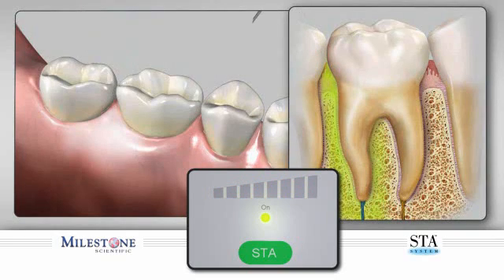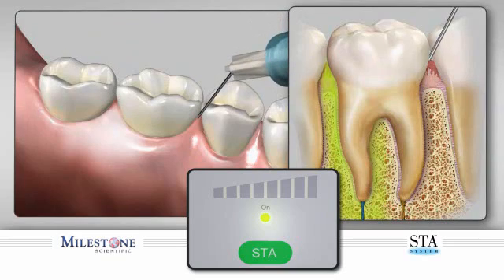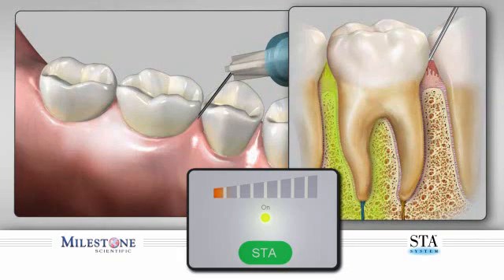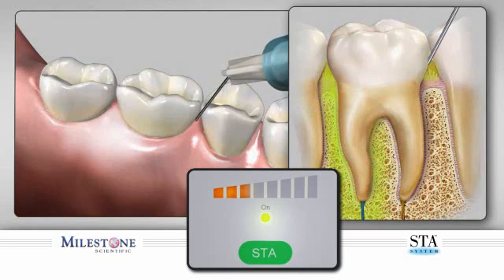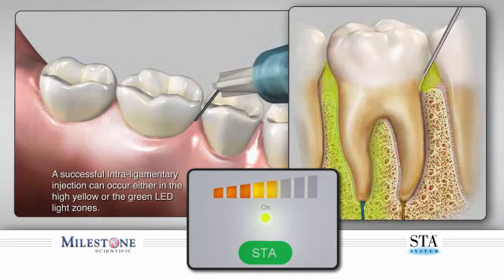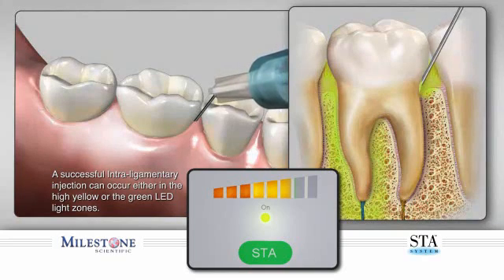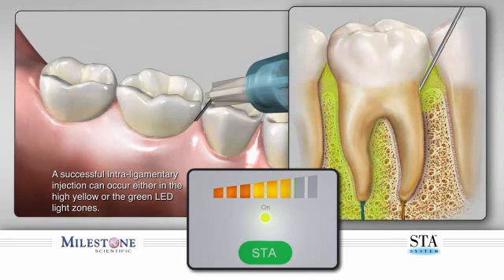Insert the needle on the mesial root of the molar. It may not be necessary to bend the needle to gain access on the mesial. Take care to insert the needle with the bevel facing the surface of the root. Slowly advance the needle into the sulcus until resistance is felt, achieved using a 45 degree angle. The STA system will once again begin to determine proper location by dynamic pressure sensing.